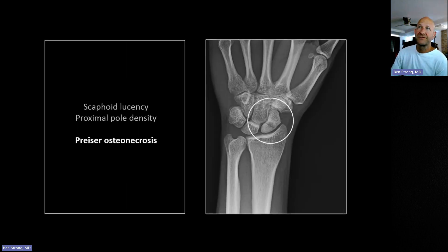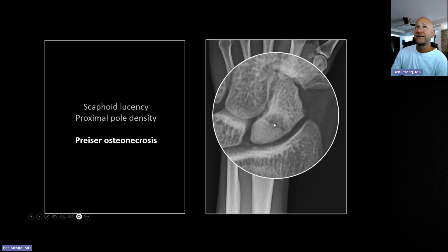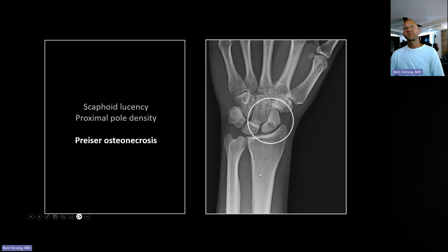The classic complication of a scaphoid waist fracture is Preiser osteonecrosis. The fracture is outlined by sclerosis of the proximal pole of the scaphoid. A branch of the radial artery enters the distal aspect of the scaphoid and supplies it from distal to proximal, so when the waist is fractured, the proximal pole becomes ischemic. The body responds with sclerosis, followed ultimately by fragmentation and collapse — analogous to Kienböck's disease of the lunate.